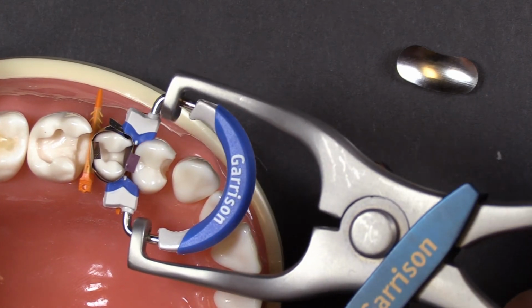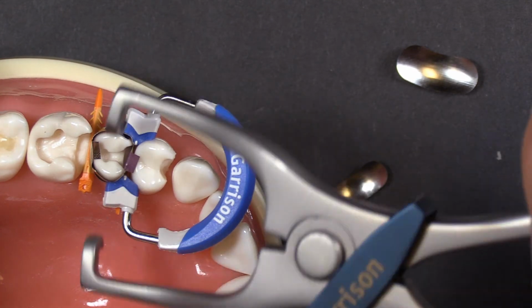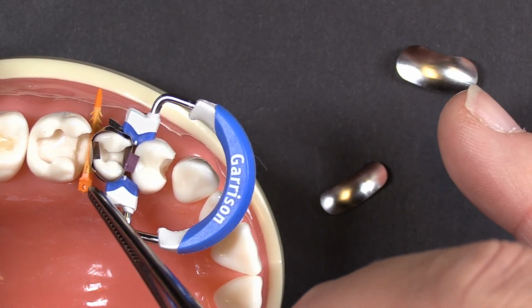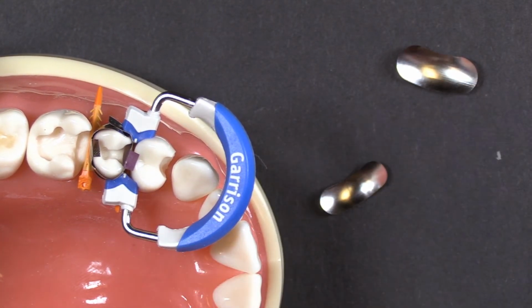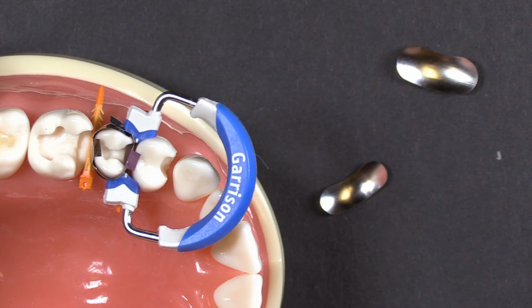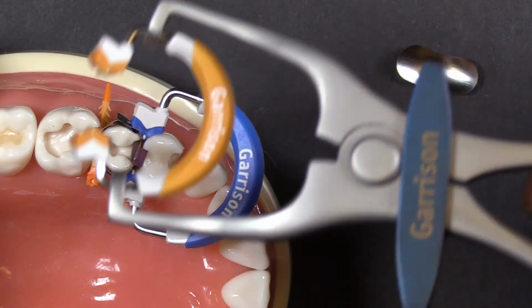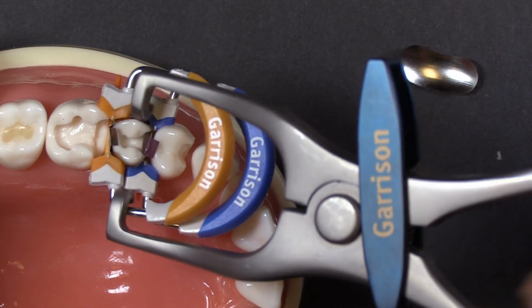You see how I had to kind of finagle that around a little bit during placement to make sure that I wasn't inadvertently grabbing the lingual side of the back band and pushing it in. It was going to push it in, so I kind of had to finagle that a little bit. That's your technical term for the day, finagle. There will be a quiz later.